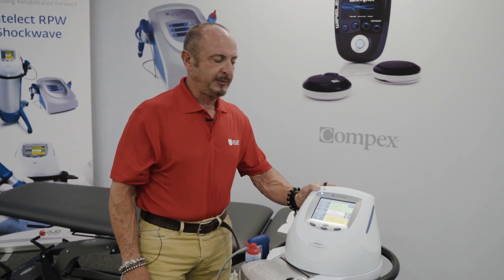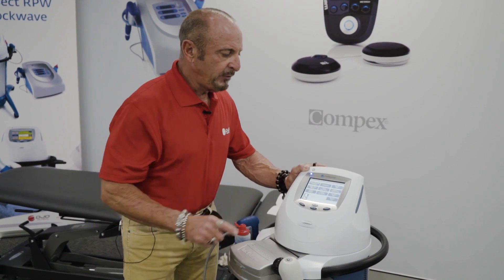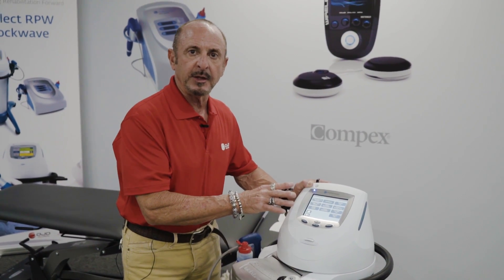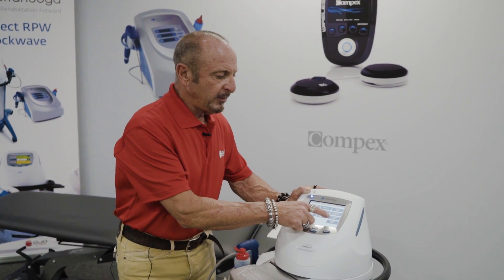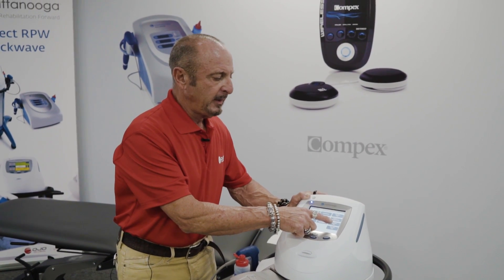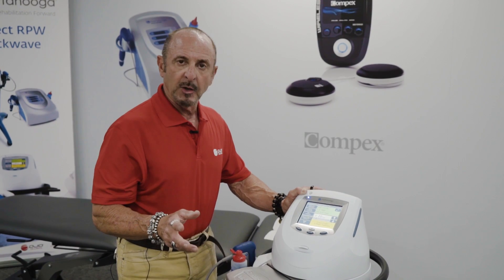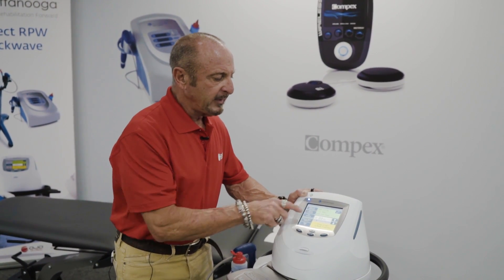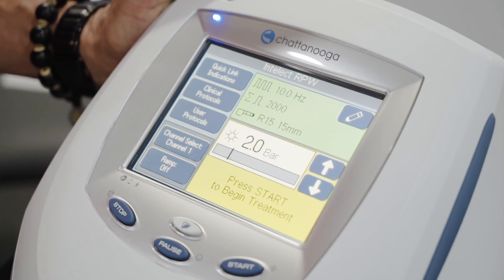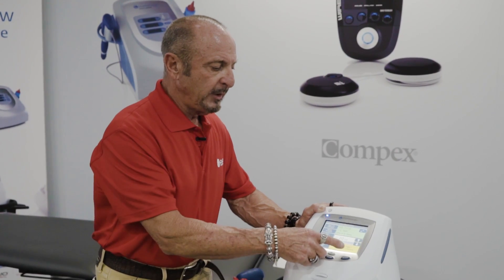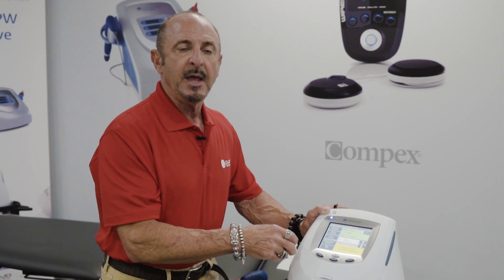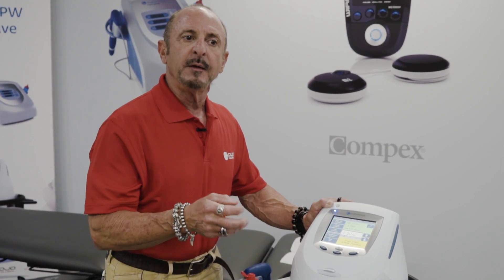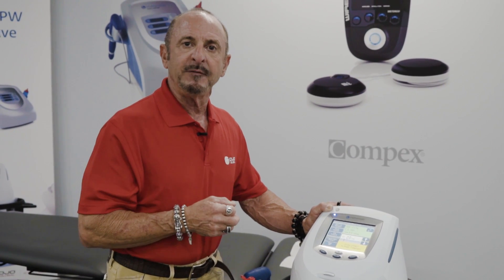Coming back to our guided user interface on our device, we choose the quick link menu which takes us into the top 10 clinical diagnoses, and sure enough I have a low back pain option. Clicking my low back pain option, it's giving me my frequency, how many shocks, and even the correct transmitter to use. All I need to do is push start and I'm ready to go.